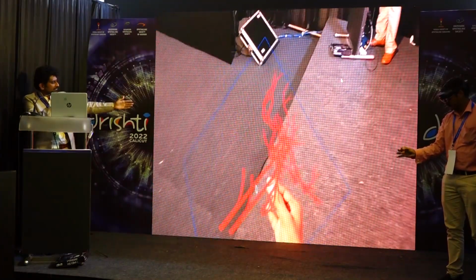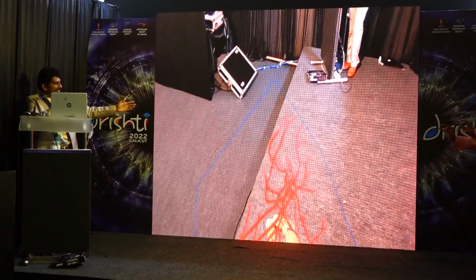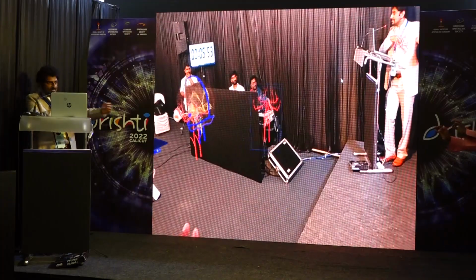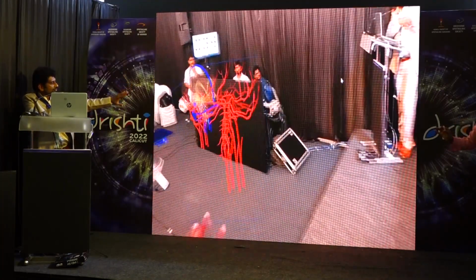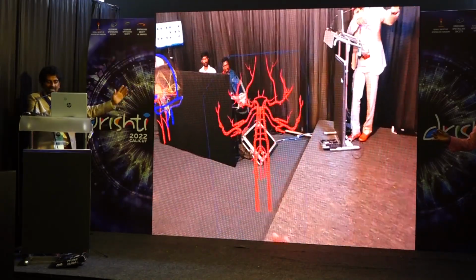But now this is a 3-dimensional structure which we sat with our anatomy books, drew the structure in 3D, and then we are trying to reconstruct it according to the patient's own case sheet. You can see that every anatomical part is there as 3D itself. You can rotate it. There is no blind spot as such. You get the structures as and when it is.